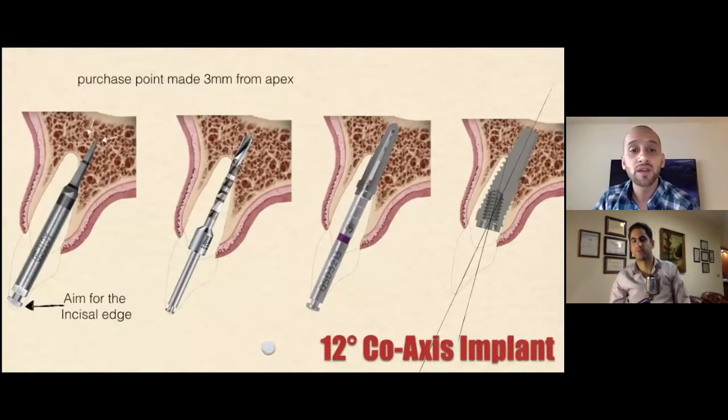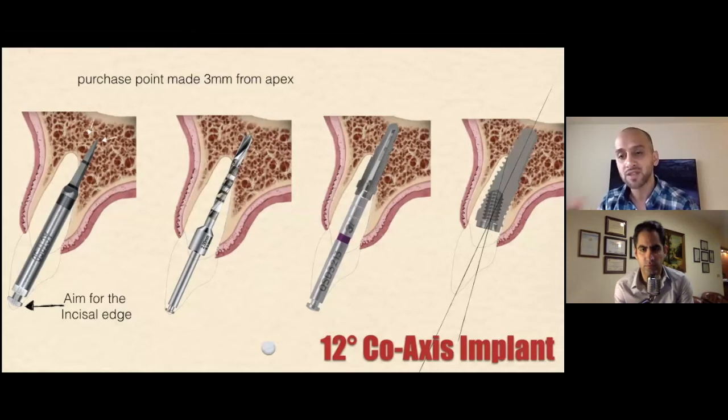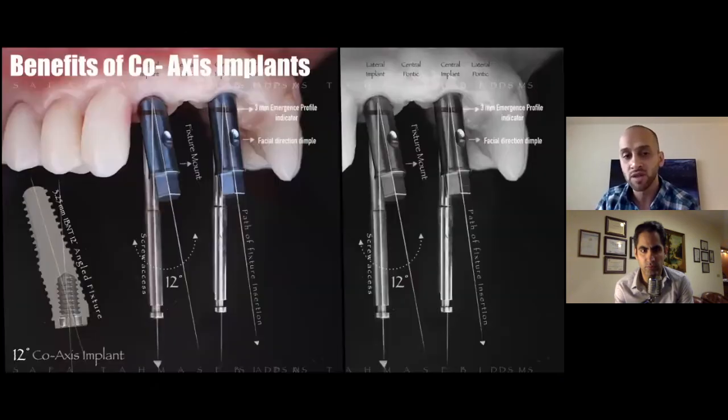The criteria that's required for the surgical placement of these coaxial implants is a little bit technique sensitive. We don't have time to go into them right now, but when we do workshop studies, we teach students how you can place these coaxial implants. There's a very technique sensitive protocol for placing these implants, but once you understand the concept of how that screw access hole is supposed to come out of the cingulum, because now you're drilling with the screw access hole coming out into another hole, it's a little bit confusing for some people, but once you get it down, it's very easily done, and you can have beautiful results with these implants.